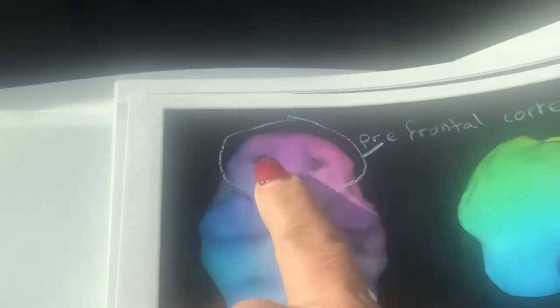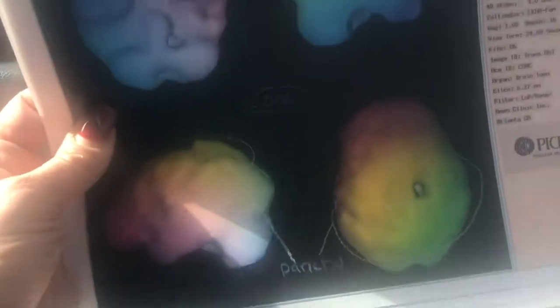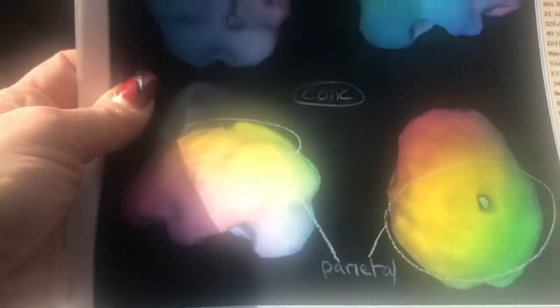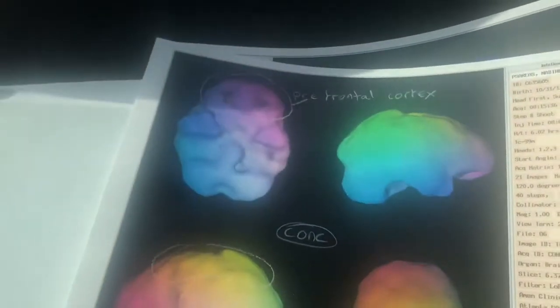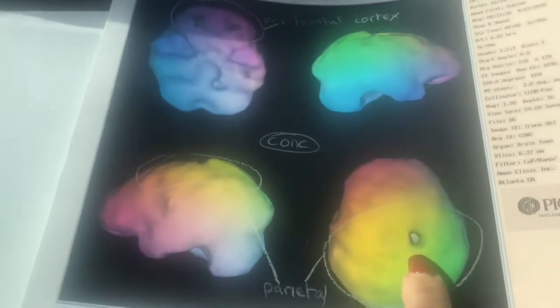What the holes mean is that there's a lack of blood flow in that area. Blood is not flowing in that area, and there's lots of dents inside there where blood is not flowing.